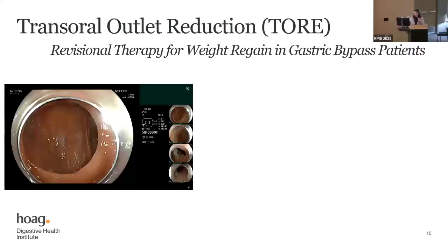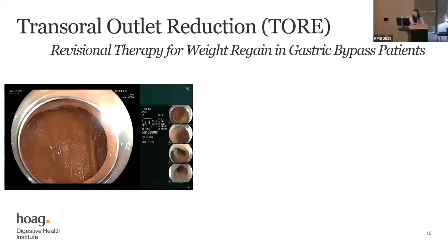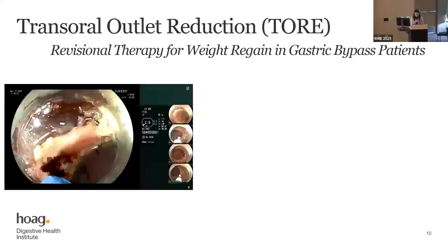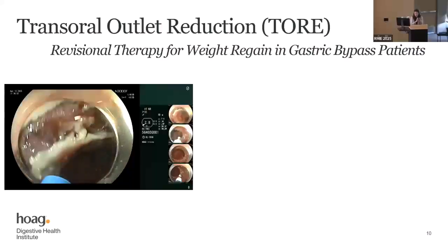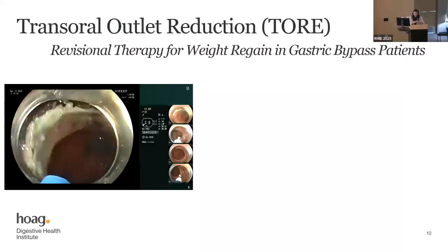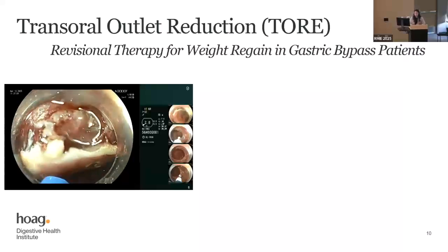The transoral outlet reduction, we saw this yesterday. So a lot of movement has been to push it more towards an ESD TORI. Yesterday we did APC because the outlet was so big that the lumen was completely effaced out because of how big the stoma was.